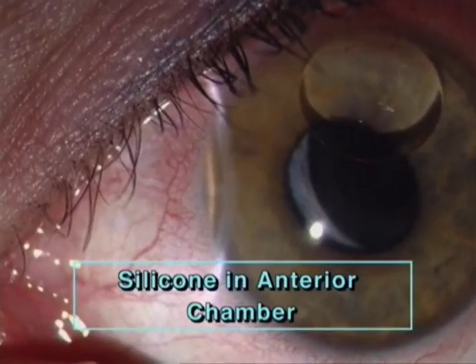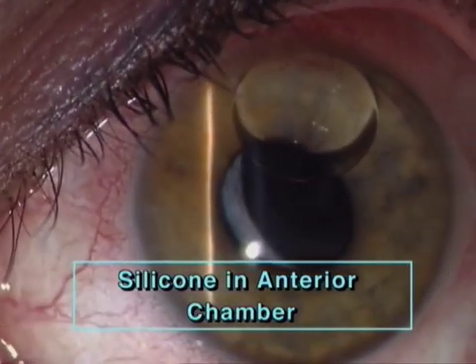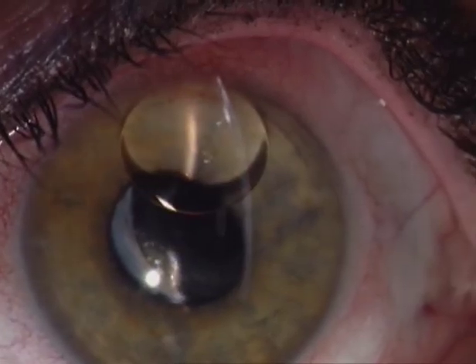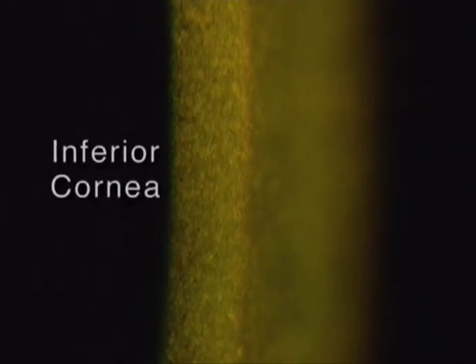In this eye, damage has been produced by a silicone bubble in the anterior chamber, and we expect this to occur mainly in the superior cornea. And indeed, observed here with a contact glass without a red filter, the cells of the endothelium in the inferior parts appear normal, small and regular. However, when we move to the superior cornea, where the silicone touch has occurred, the cells show irregular sizes and shapes.